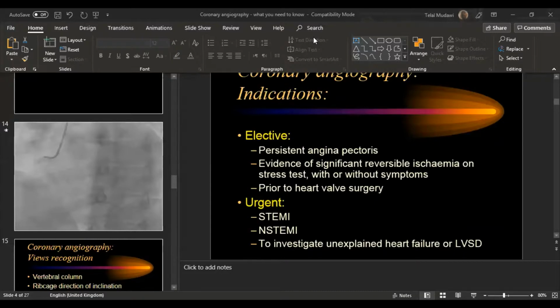فده مثال. في امثلة ثانية طبعا، بيجيك العيان بتاع الكارديوجينيك شوك، you can fail the radial بلس، اصلا ما في راديال بلس والفيمورال فيبل جدا. ففي الحالة دي بتخش فيمورال احسن لك، لانه في النهاية الفيمورال ذاته بتستخدمه للبالون بامب اسرع. في other situations تلقى العيان عامل له باي باس اوبريشن وشايلين الليفت راديال، وعامل له ليما. فانت عشان تخش الليما ما بتقدر تخش بالرايت راديال، لانه قصة صعبة حتكون بعد ذاك نافيجيت الاورتيك ارش وتنزل وتطلع ثاني بالغالب. فيو هاف تو جو فيمورال لانه الليفت راديال السيرجن شاله. فدي بعض الحالات اللي بتضطر تخش فيها فيمورال.